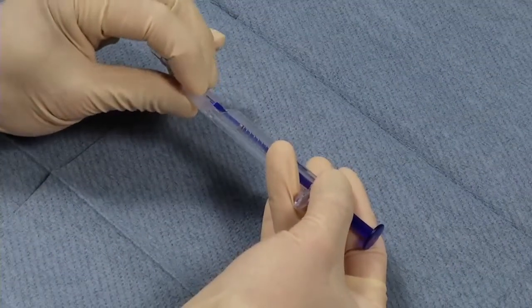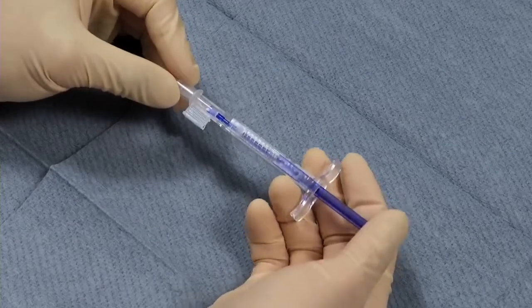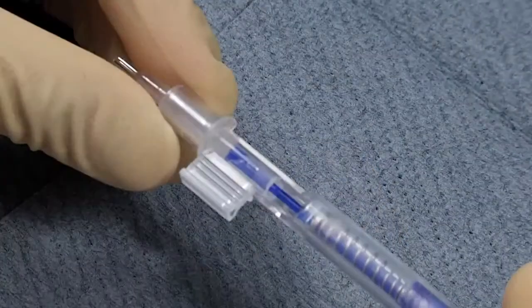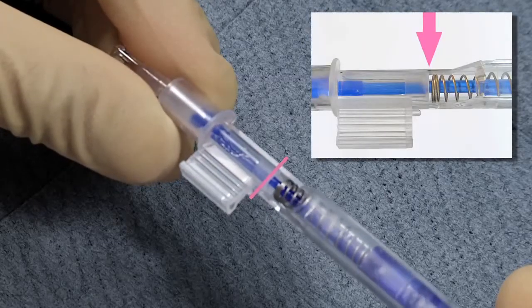Next, close the cartridge wings together until the click lock mechanism engages, and then push the lens into the conical tip by advancing the plunger until the spring just contacts the outer edge of the cartridge wings.